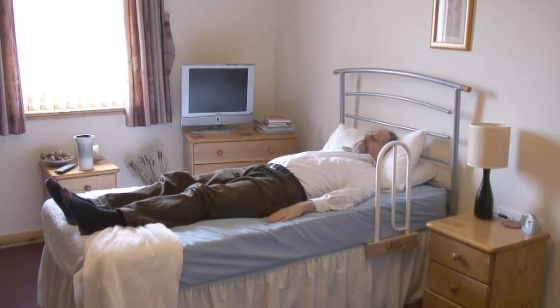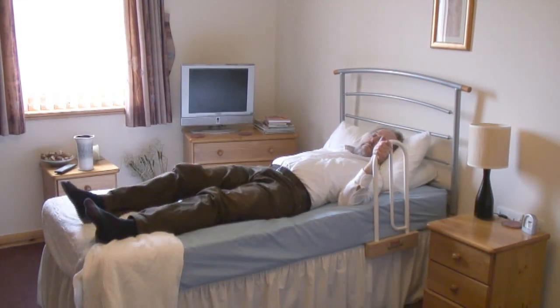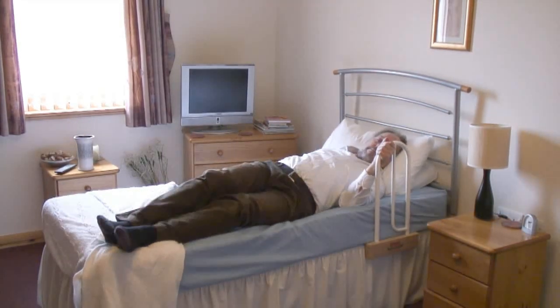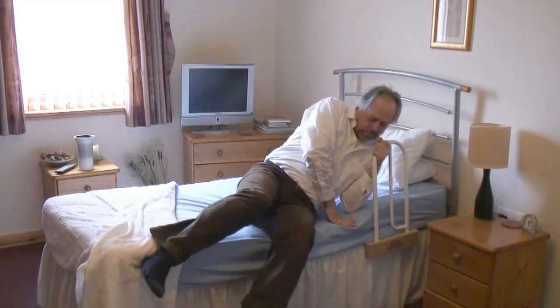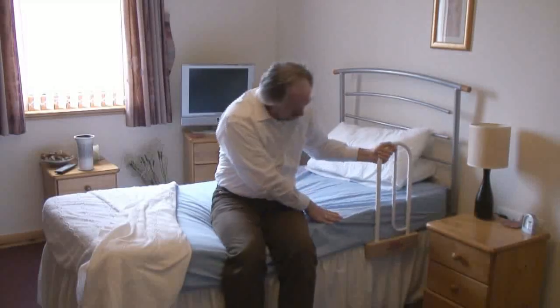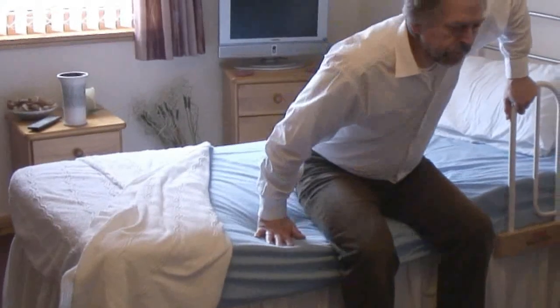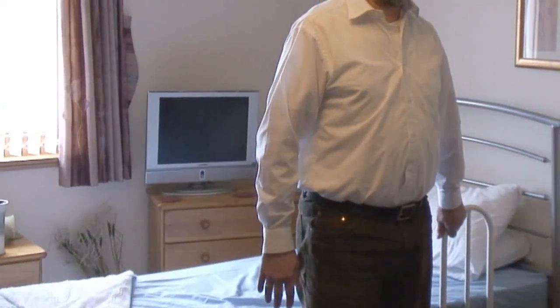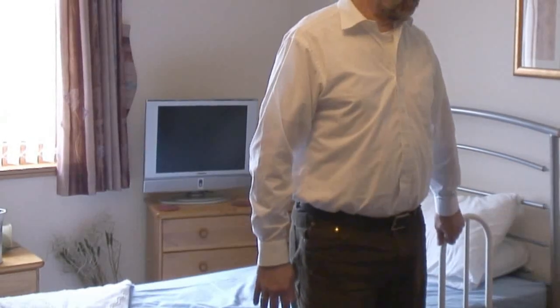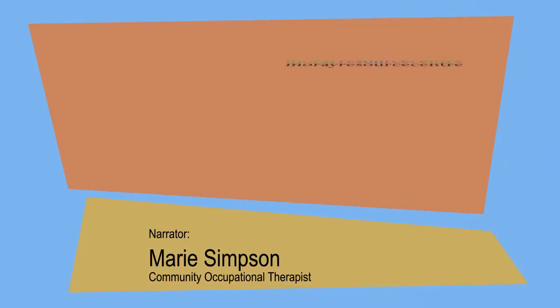Getting out of bed is really where the bed lever probably has the most benefit — it just gives you that bit of purchase. Pull yourself over towards the edge of the bed, closer to the edge, and pull yourself up. Just your hand on there as you go to push up. And that takes away the need for grabbing onto nearby dressing tables and bedside units, which aren't secure and which often over time can start to come apart as well.